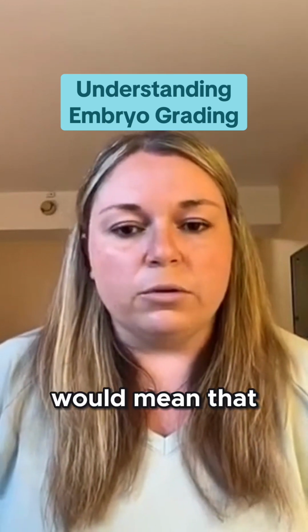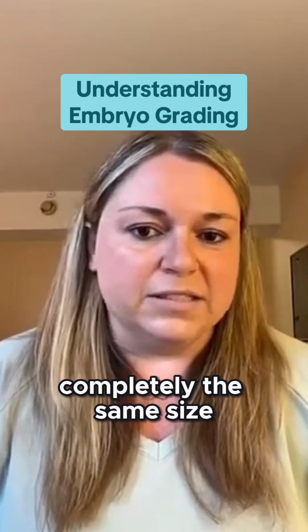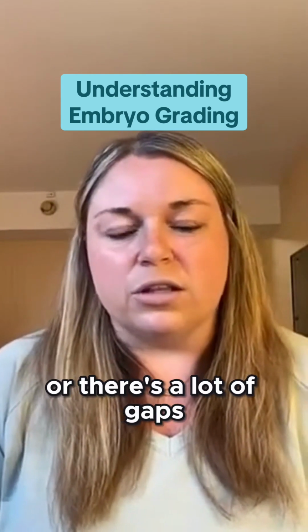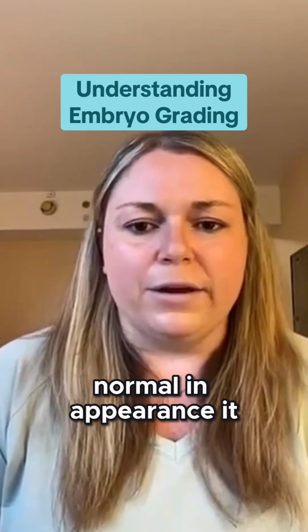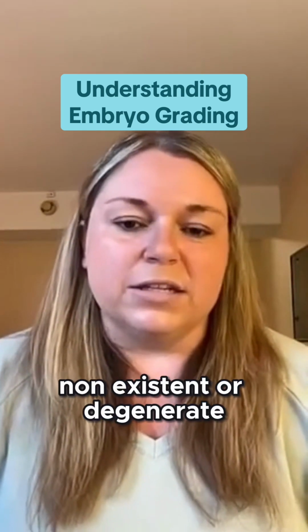A B grade would mean that the cells are there. There might be a couple of gaps. Maybe they're not all completely the same size. That would be a B grade. If there's really not a lot of cells, or there's a lot of gaps, or the cells are just not very normal in appearance, it would probably be a C grade. And then, of course, a D would be non-existent or degenerate.